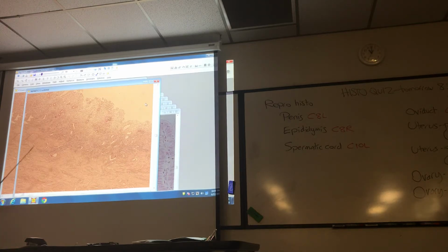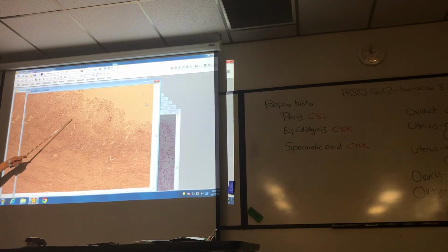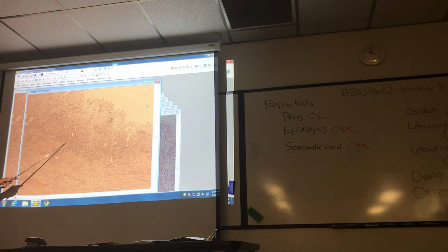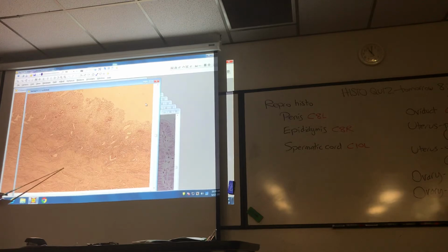All right. Which layer is it? What do you think? Endometrium. We are in the proliferative phase. Very good. But do you see how the tissue changes right around starting there? So below this, what would you call this layer? Myometrium. That's it. Endometrium, myometrium, a couple other things.